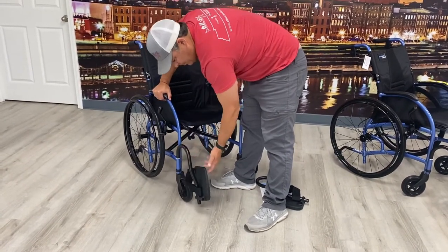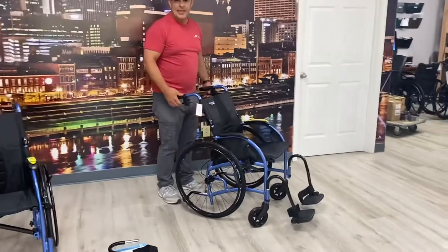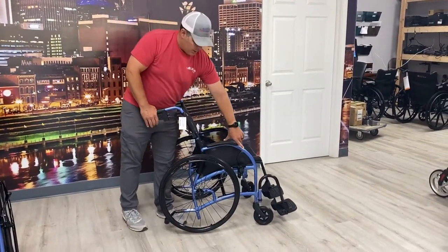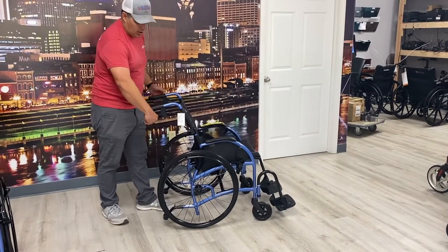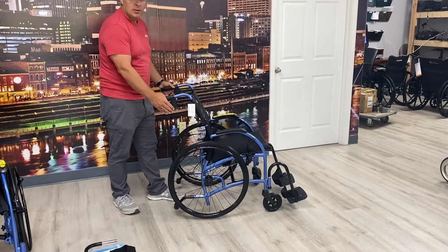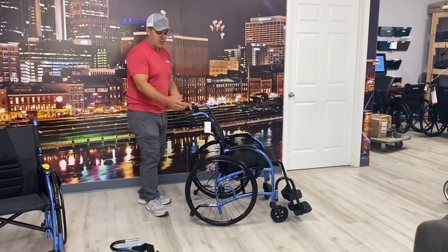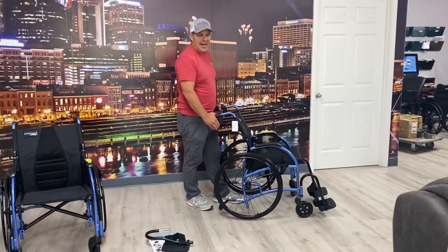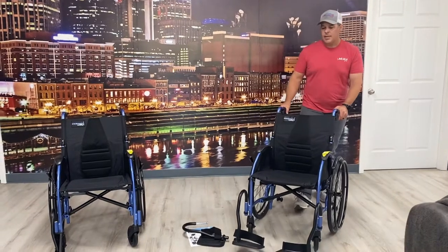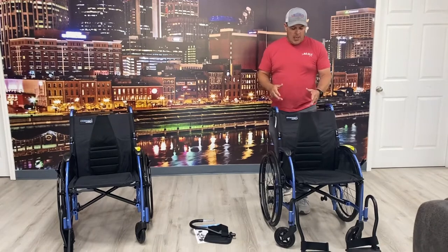The other version that I have over here has attendant brakes. You'll notice when I squeeze that, the brakes are moving. I can also push down and lock the wheel locks from right here. That's a nice feature — if the individual can't lock the brakes himself and you're using it as a transport chair, you have the ability to do it from the backside. They call these attendant brakes.